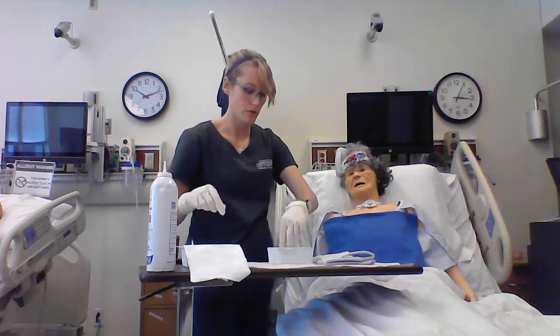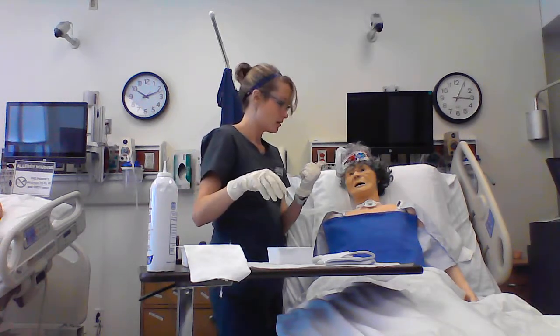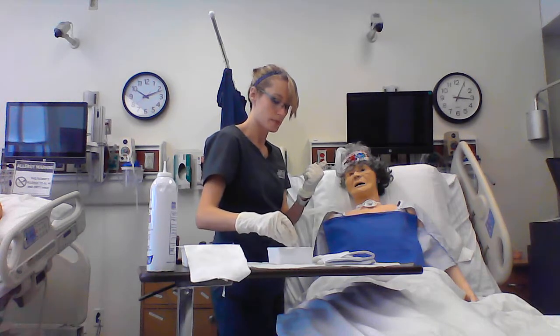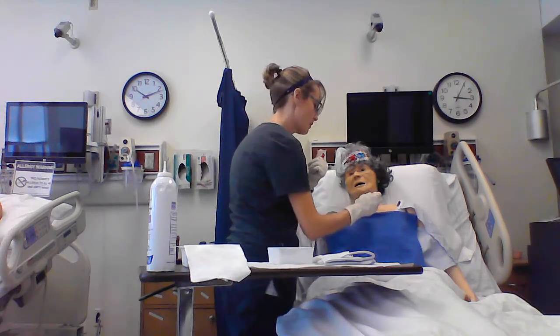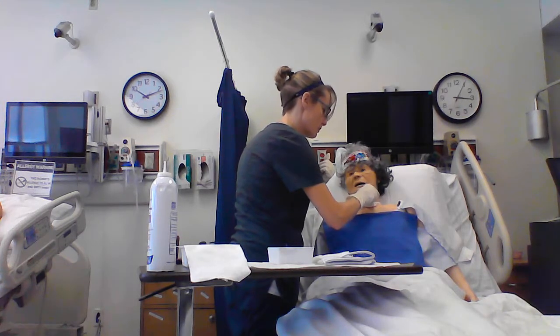And then I'm going to soak that in normal saline to soak off all that hydrogen peroxide. So soak that. Tap this cannula off. Get all the excess water off. Not water, saline, excuse me. All the extra liquid off, so you don't introduce that into your patient's airway. Reinsert with your sterile hand and make sure that it's secured in place.